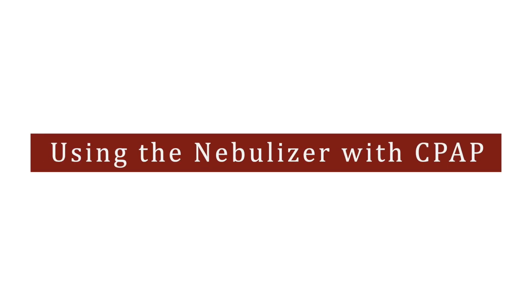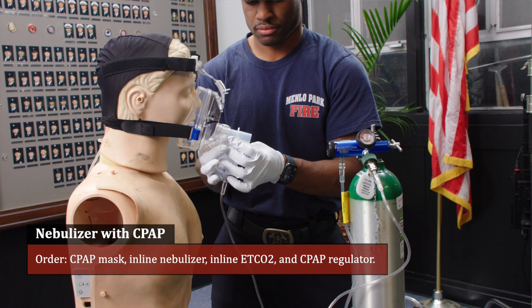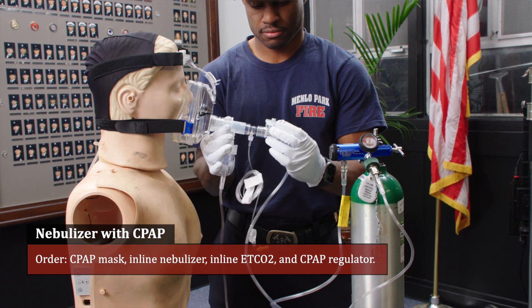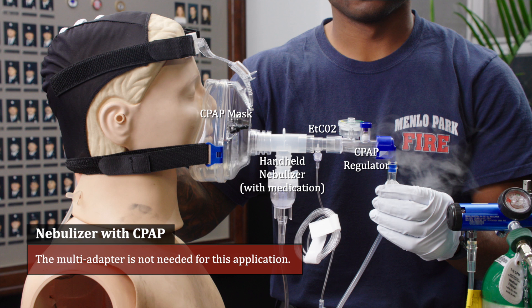To use the nebulizer with CPAP, you will set it up in the following order: CPAP mask, inline nebulizer, inline end tidal CO2, and CPAP regulator. The multi adapter is not needed for this application.